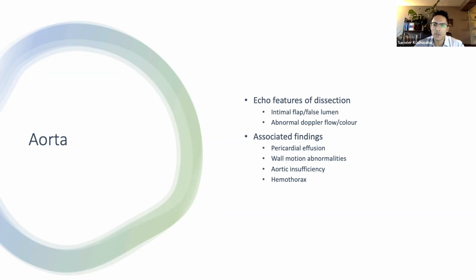We look for aortic insufficiency because of possible dissection into the aortic annulus, causing disruption of its structure and malcoaptation of the aortic valve cusps. And we can look for a hemothorax, which may suggest pseudoaneurysm or rupture of the aorta, which would also be accompanied by very severe hemodynamic instability. And then we can look for other clinical or biochemical signs of end organ dysfunction, such as neurologic symptoms, renal dysfunction, back pain, bowel ischemia.